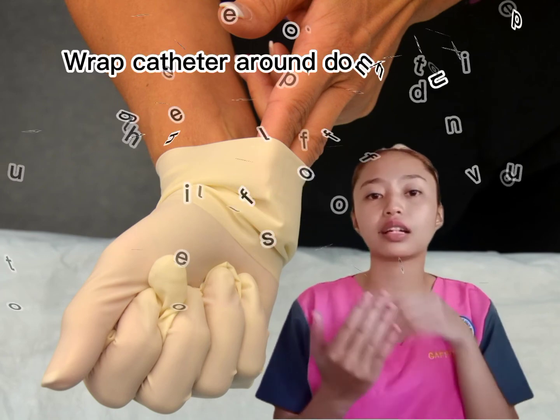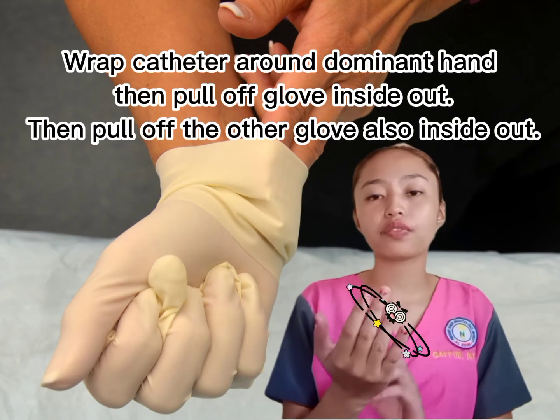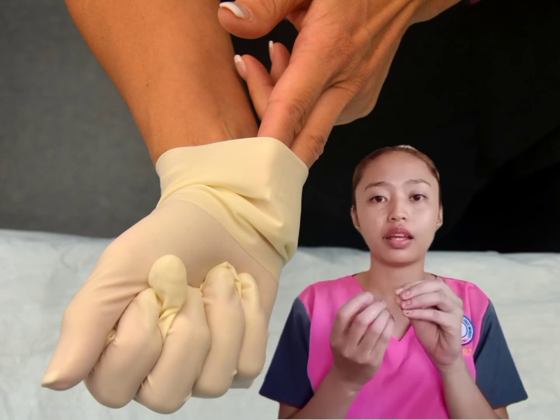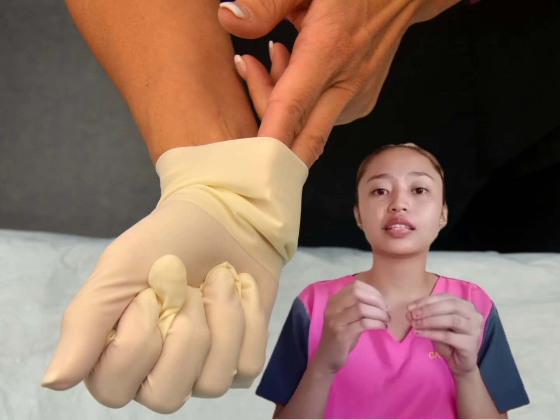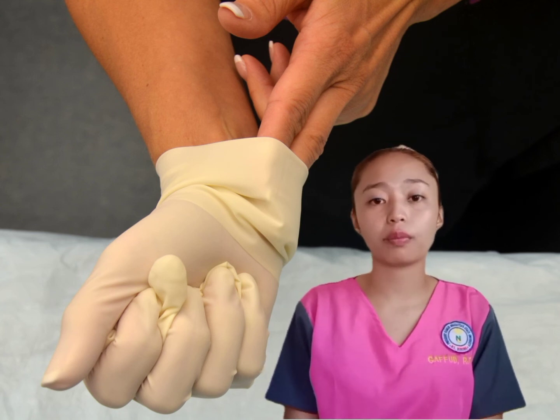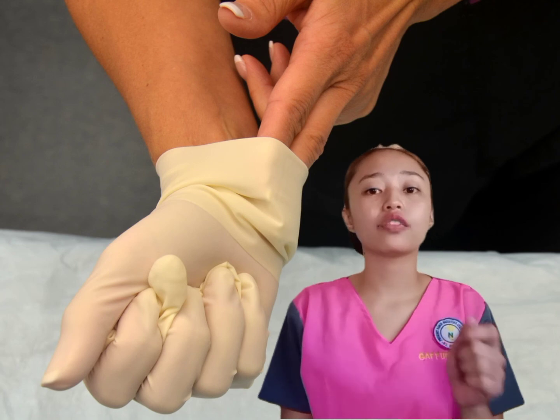Wrap the catheter around the dominant hand. Pull off the glove inside out. Then the catheter will remain inside the glove, and pull off the other glove in the same fashion and then discard. This process will reduce transmission of microorganisms. Then, turn off the device.